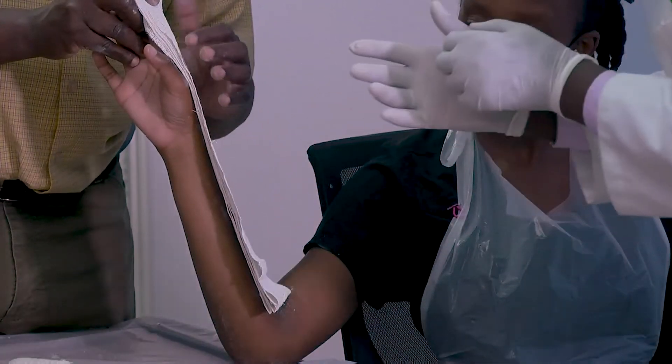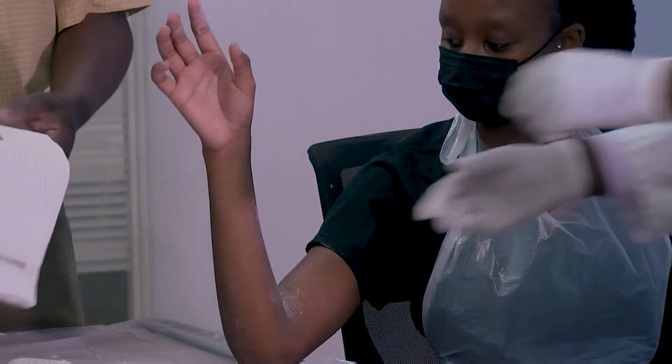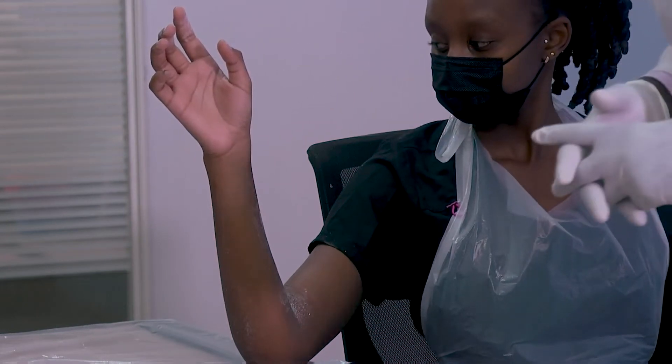So you cut this small piece here so it allows the thumb to slide into that space. Yes, exactly. We are using our plaster cutting scissors, as you can see. It is very important to have your materials and your tools ready.